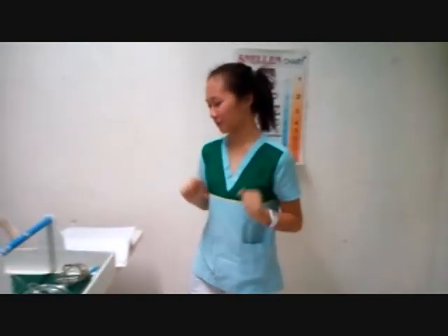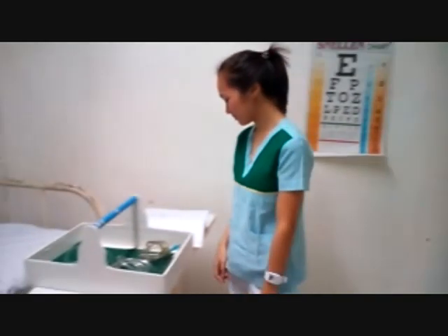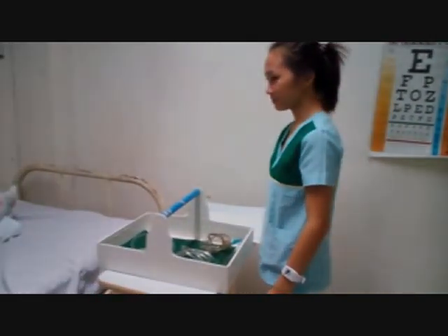Hi, I am Lois Fabi-Arkaya and I am going to demonstrate how to properly administer oxygen by mask.